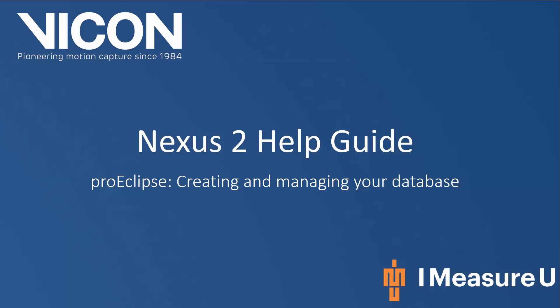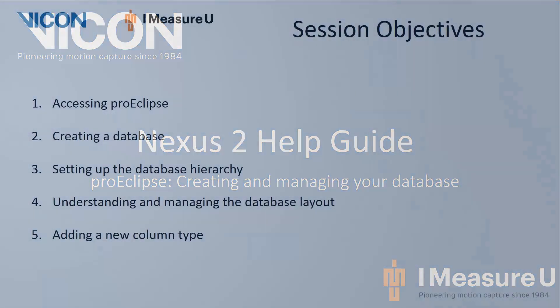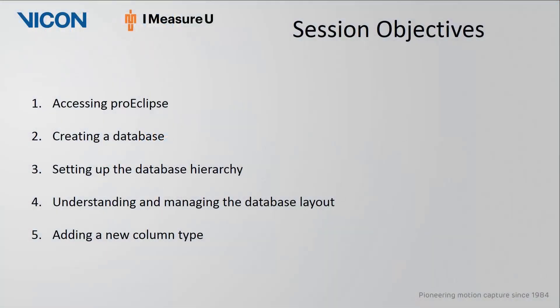Welcome to your Nexus 2 help guide. This session will discuss how to use ProEclipse to create and manage your databases. In this session we will discuss five main topics: accessing ProEclipse, creating a database, setting up the database hierarchy, understanding and managing the database layout, and how to add a new column type.